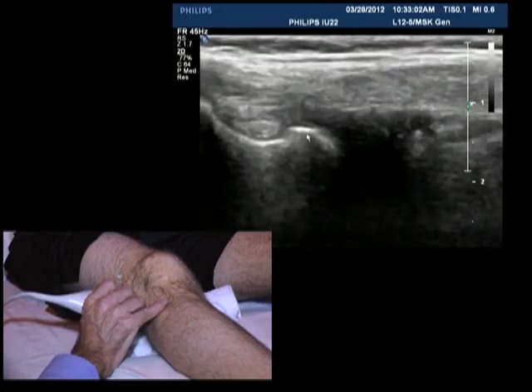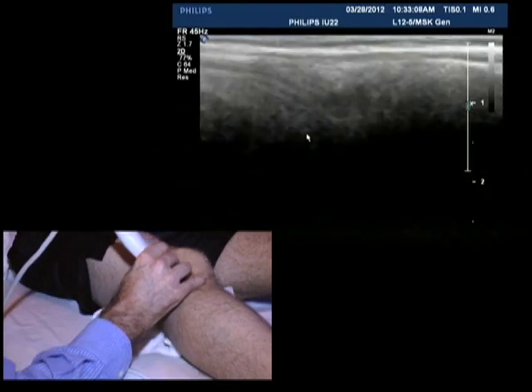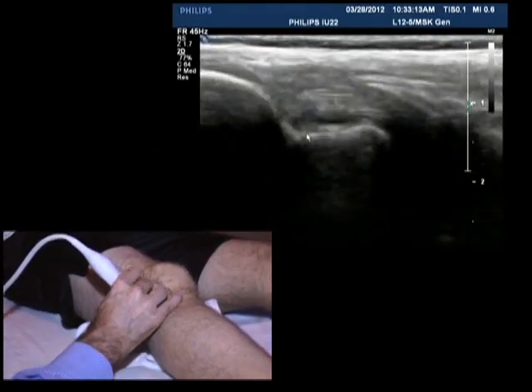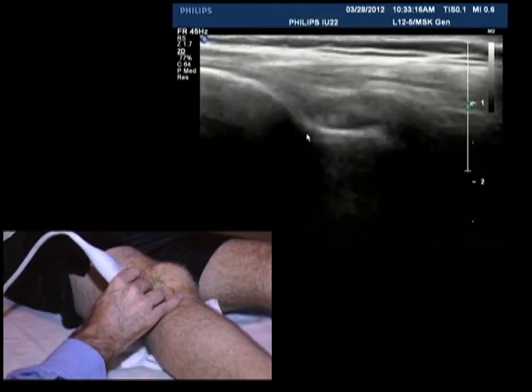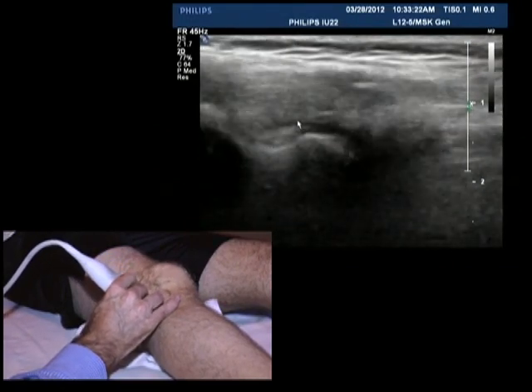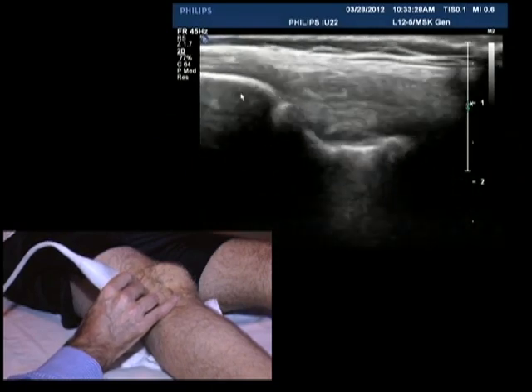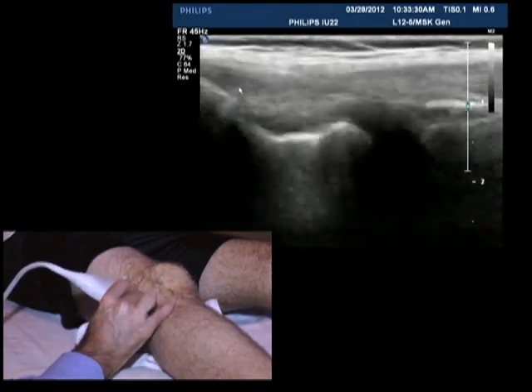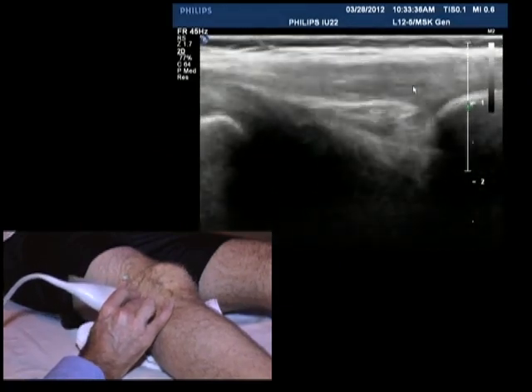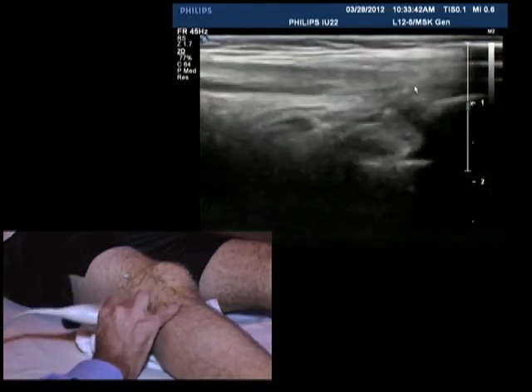Which is going to run, which is, I think, if you remember what I said, could be difficult sometimes. So here's a notch for the popliteus, and then the fibular collateral ligament is going to take origin just above the notch for the popliteus, and it's going to run downwards and then downwards to insert with the biceps on the fibula.